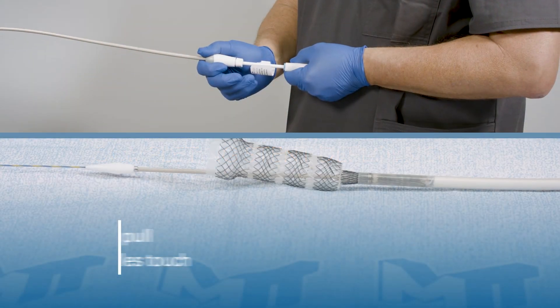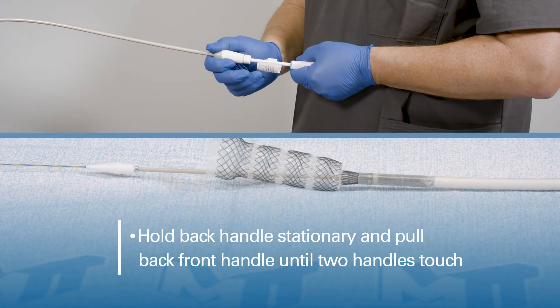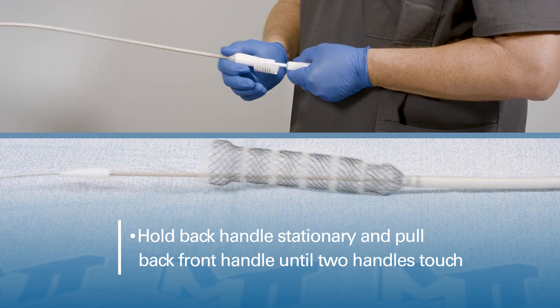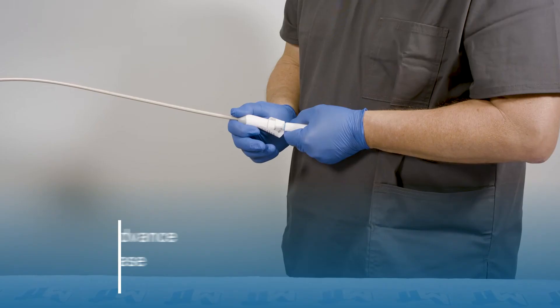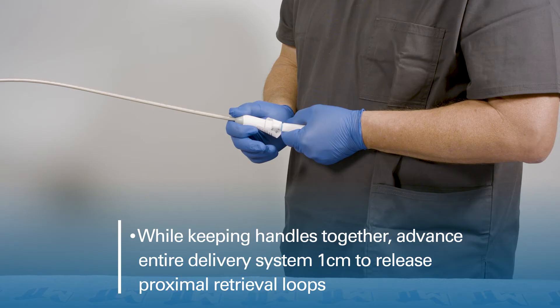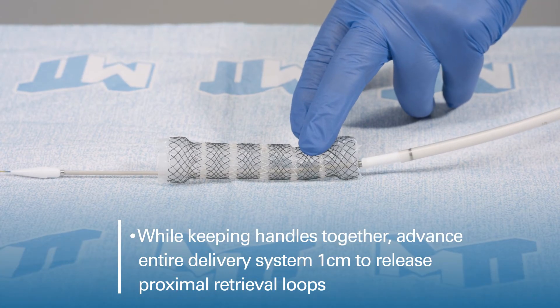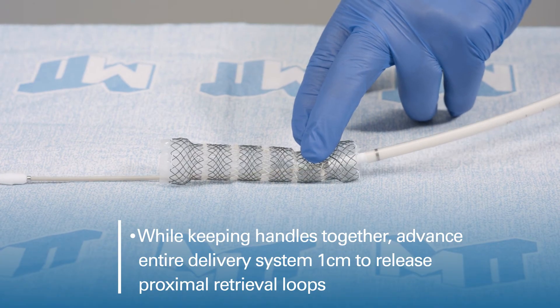To complete deployment of the stent, hold the back handle stationary and pull back on the front handle until the two handles touch. While keeping the handles together, advance the entire delivery system one centimeter to release the proximal retrieval loops.